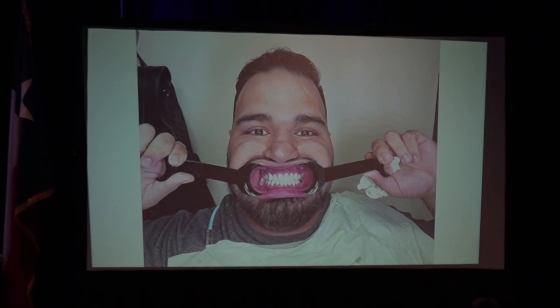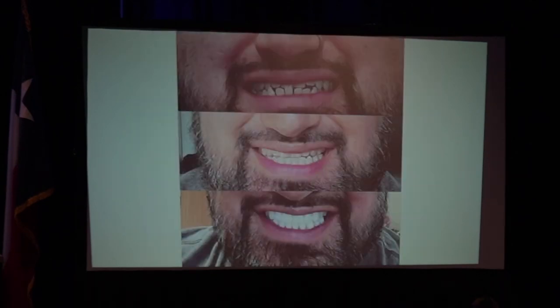I was just showing the process because people were asking. I think of these things to do because people are like, hey, can I do this? Yeah, you can do anything, but are you going to wait for it? I can deliver the temp the same day, but you've got to wait for it. So there's benefits to converting, but the conversion takes about 2.5 hours. I can get my thing designed and printed in that same amount of time, or 2 hours, depending. So that's what we started off. He started off in January. I finished his case in May with ortho and everything. We do accelerated orthodontics. It's a whole other lecture.